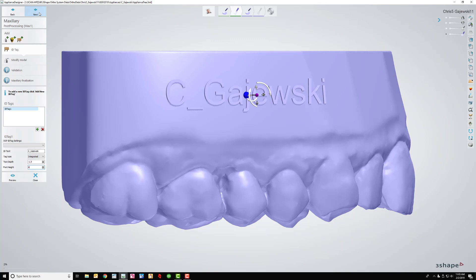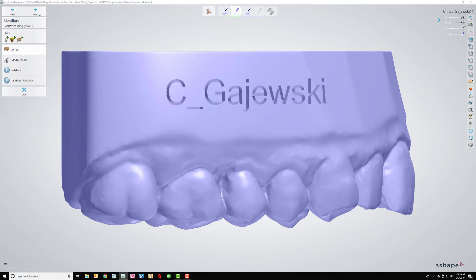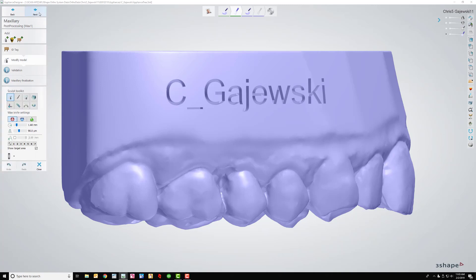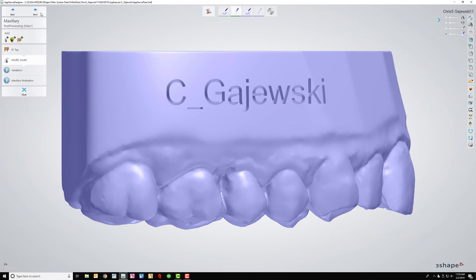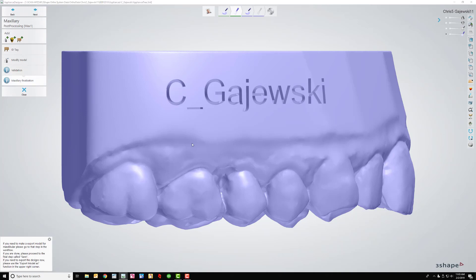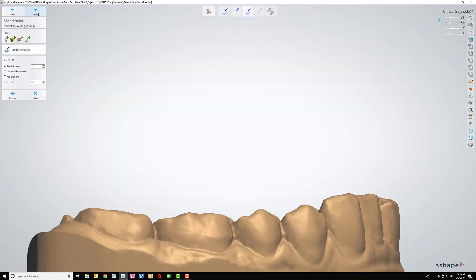And then we've got to go through a bunch of steps that I don't even know what they're there for. Again, this is something else that I'm looking for help with if I can change this, because Modify Model, next, I don't need it. Everything's been modified the way that I want it to be. Validation, I don't even know what that is, next. And then it's going to go into Maxillary Finalization. Now if all that I had was a maxillary or a lower, I would just start the export process now, but I don't. So I'm going to click next.